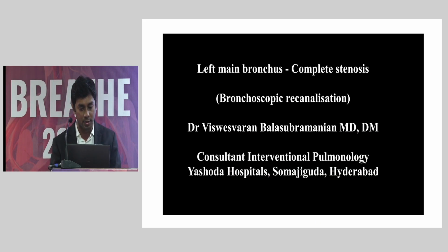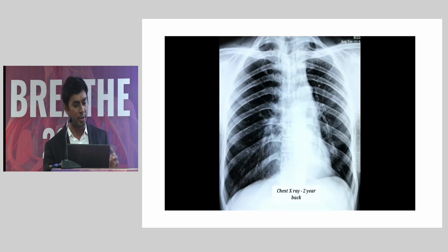upper lobe bronchus. Similarly, in the interest of time, I'll take you through one last case to make you understand how severe your endobronchial TB can be. So this patient actually came to us all the way from Bengal. The X-ray you are seeing here was done before the initiation of treatment for sputum positive tuberculosis. The patient was started on ATT.